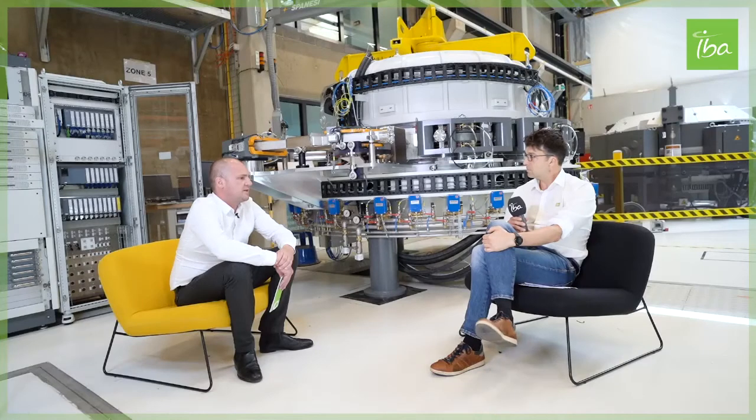Yes, and even before the COVID crisis, we did a lot in terms of remote control connection. Right now we are able to have access to all the machines using a remote connection. So it's faster because we can tune the machine using remote control connection. We also provide some cameras to the customer, to help the customer during the COVID crisis, because we have to maintain the machine. But we want to take a step forward.